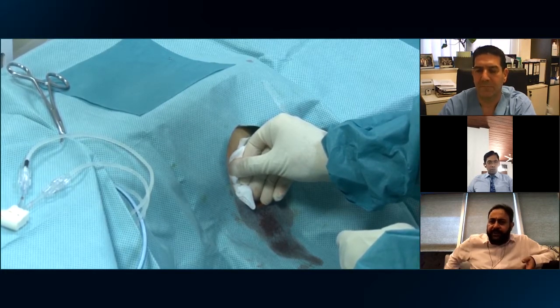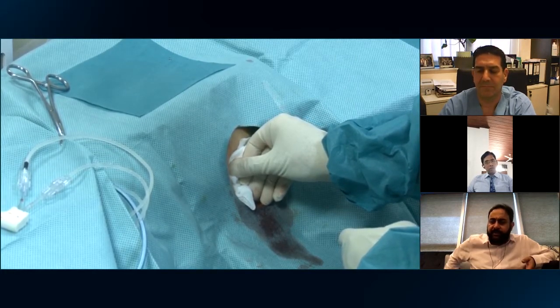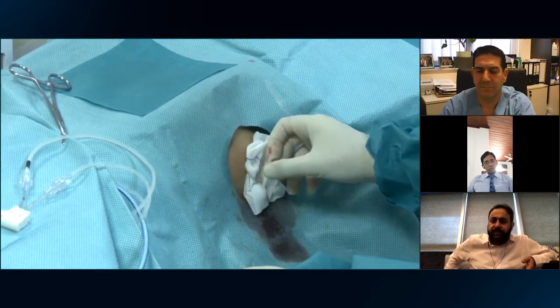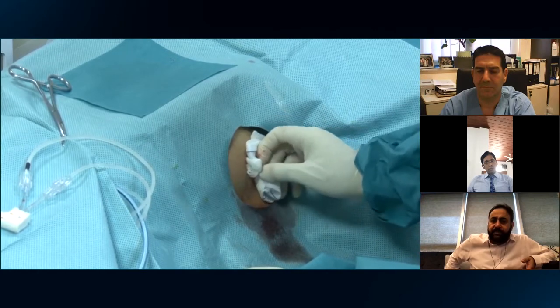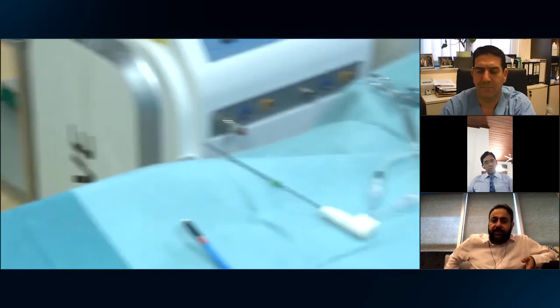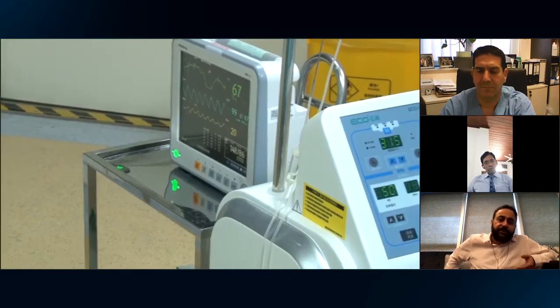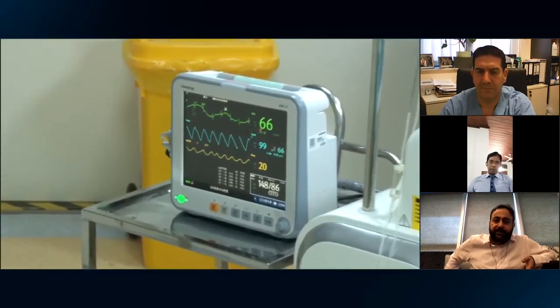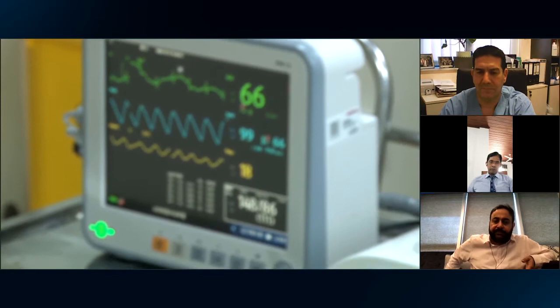You normally do track ablation. I prefer to do track ablation. You mean 2-track ablation, double antenna? No, not double antenna. Towards the end of the procedure, when you are withdrawing it, there is a track ablation protocol. Oh, track ablation. Yes, we do.